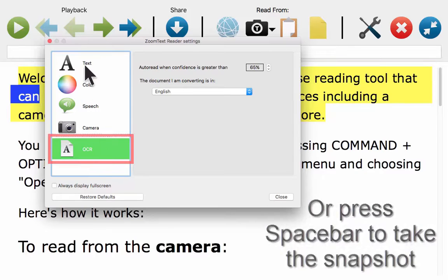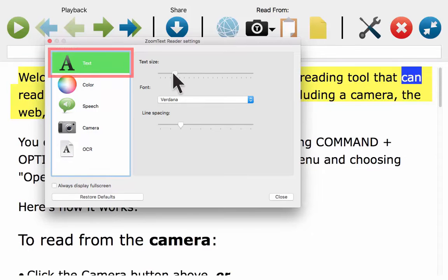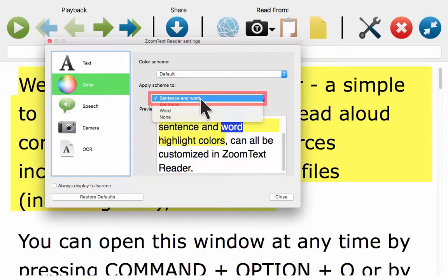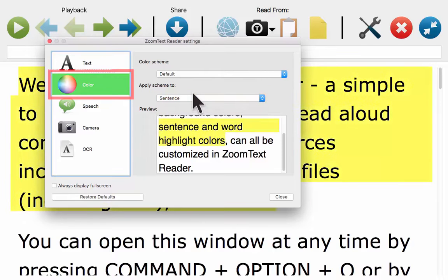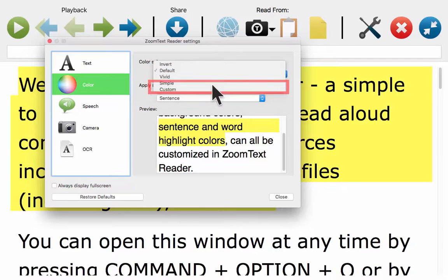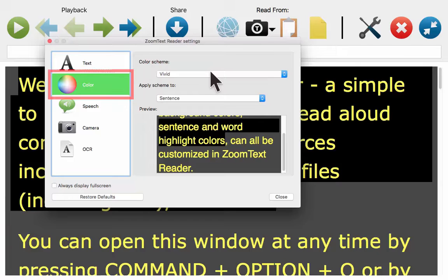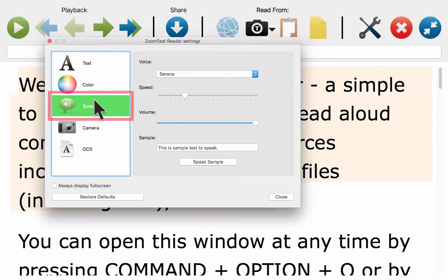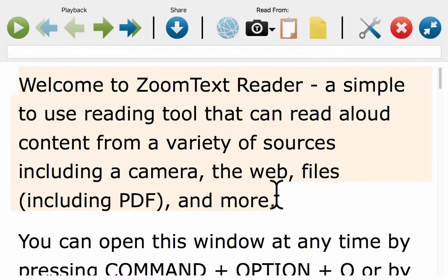While we're in here, there's a text option for this window — you may decide you want bigger text, and you can choose your colours. You might want a word or sentence highlight scheme as it reads — applying to a word as it highlights or the whole sentence. You can choose a colour scheme: Simple, Vivid, or Peaceful — the choice is yours. There are also speech settings within this window where you can choose your voice, speed, and volume, and click Speak Sample to check it.